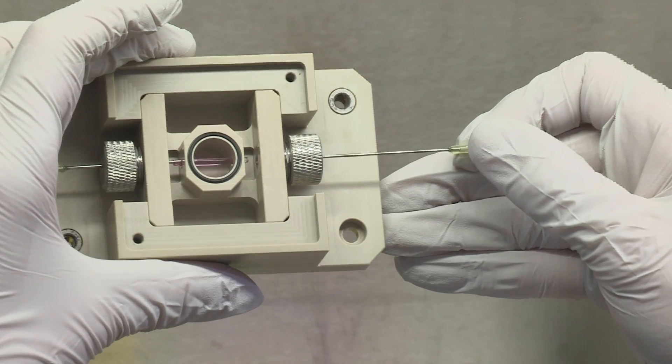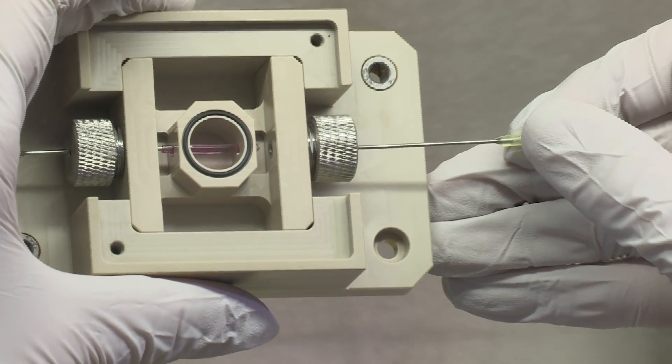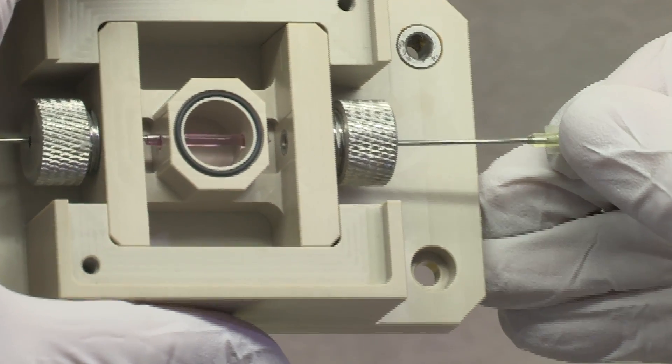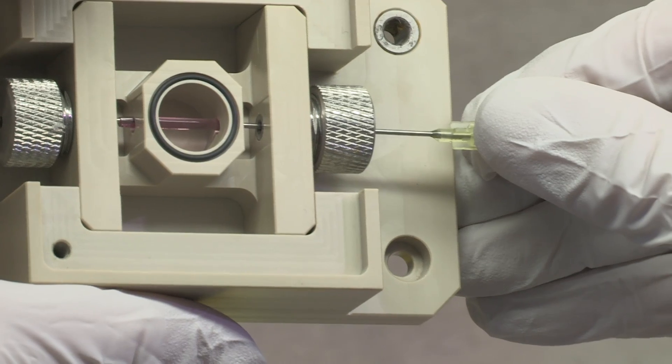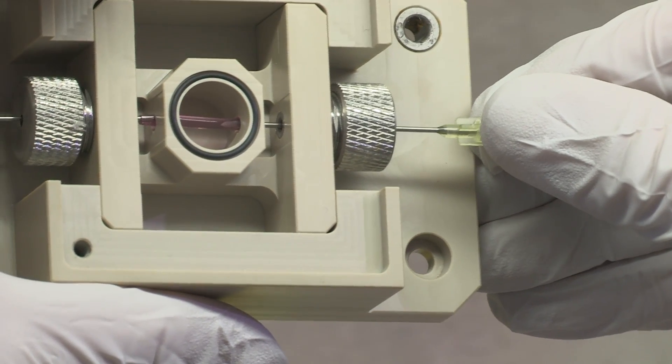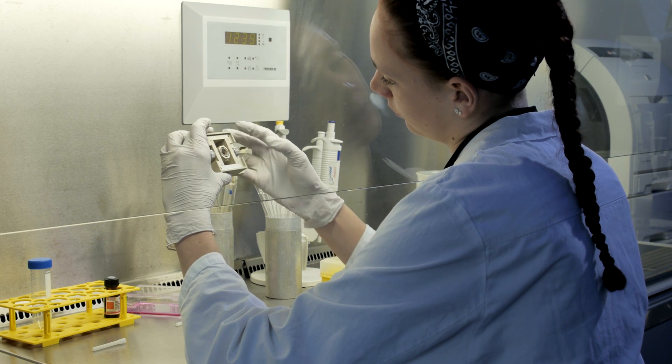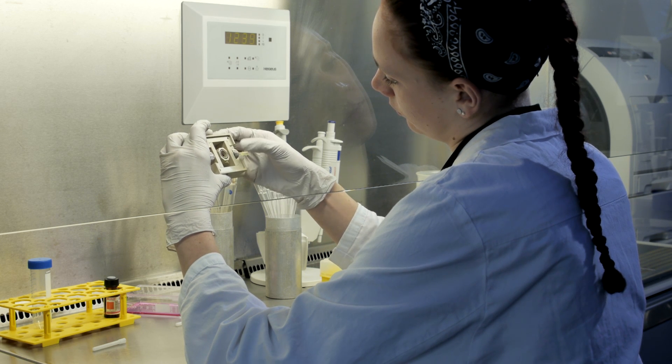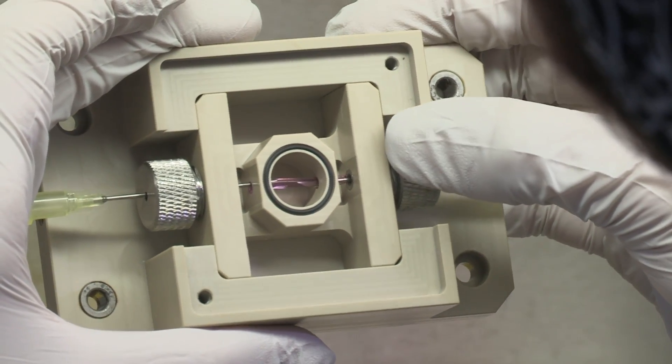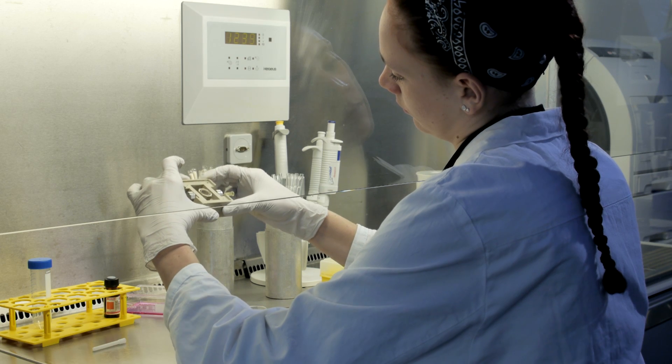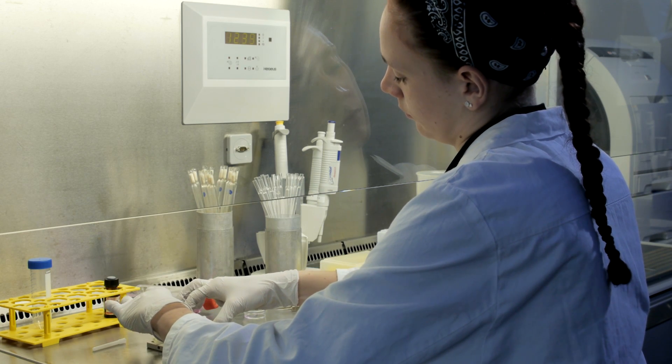Currently, the assembly of the tubular system is still done manually. In the next step, the cell culture medium is flushed through the tubes just like blood in real blood vessels. The aim for the future is to perform the complete assembly automatically in order to produce high numbers of identical tissue.